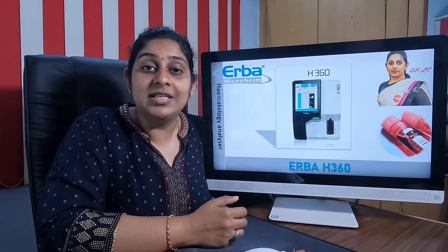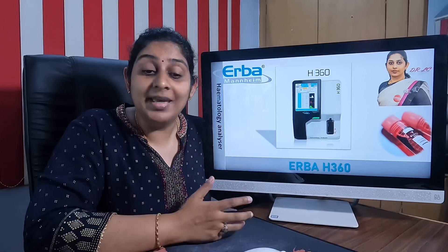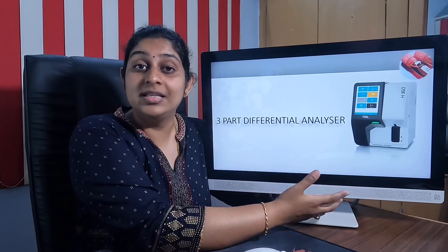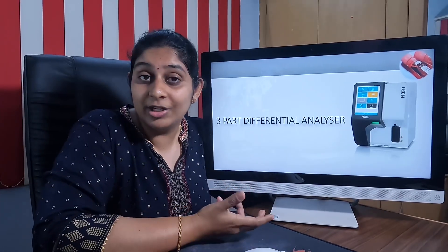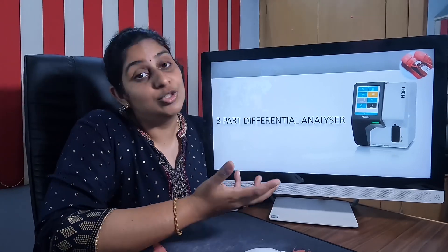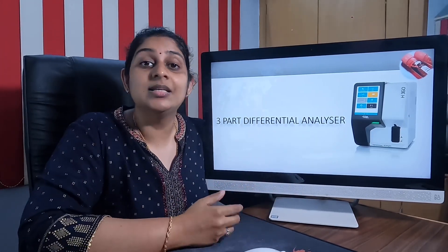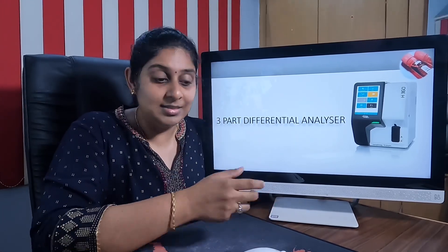In this IVD series, the first machine we are going to see is the Erba H360, which is the basic three-part hematology analyzer. The H360 is a very compact machine; it weighs around 25 kilograms and is a tabletop machine. As the number suggests, the '3' in 360 stands for the three-part differential analyzer.